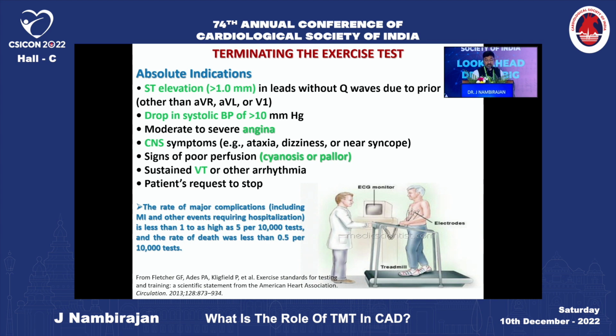So the absolute indications for terminating the test are ST elevation of more than 1 millimeter in leads without Q waves, a drop in systolic blood pressure of more than 10, moderate to severe angina, CNS symptoms, signs of poor perfusion, sustained VT and other arrhythmias, and most importantly, the patient's request to stop.